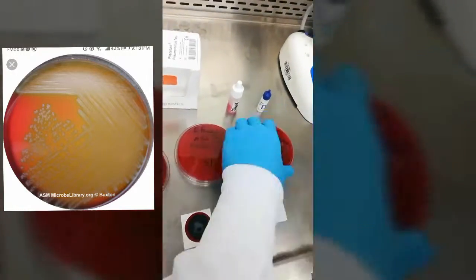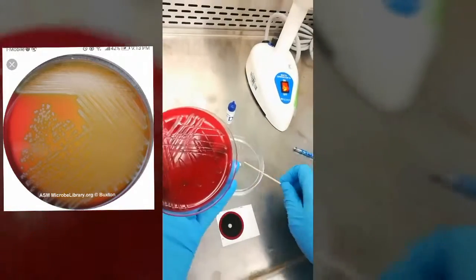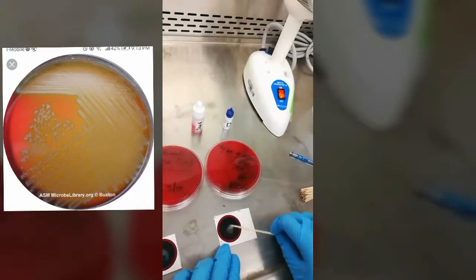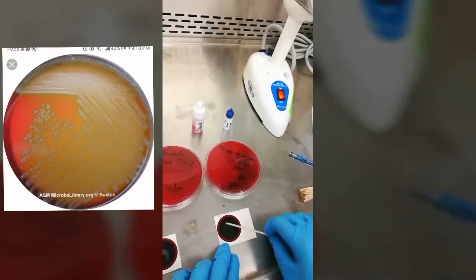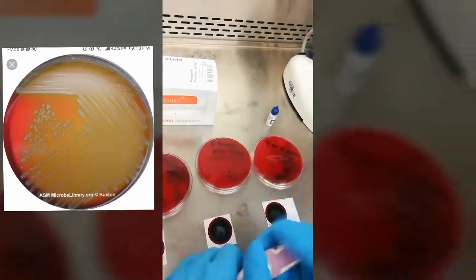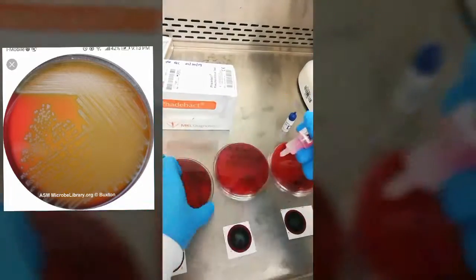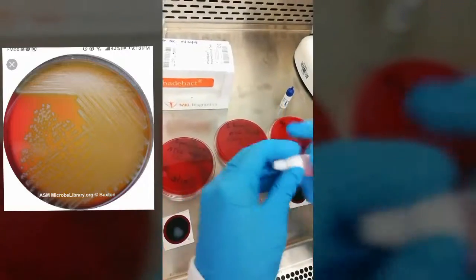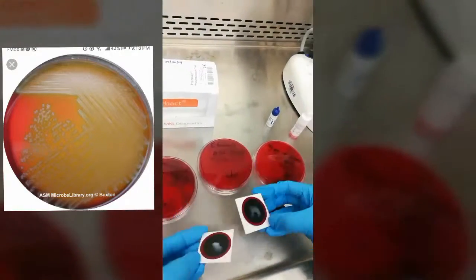For Streptococcus pneumoniae, PYR is negative. Streptococcus group D test is negative. Pneumoslide test is positive. Catalase test is always negative.